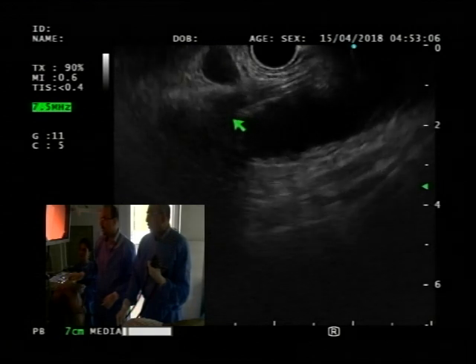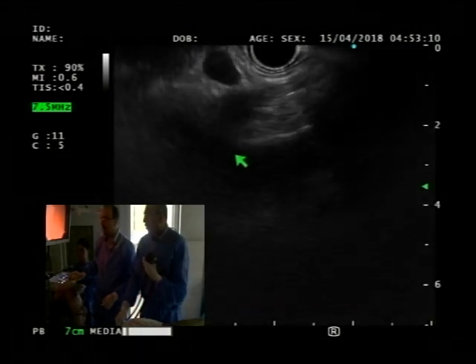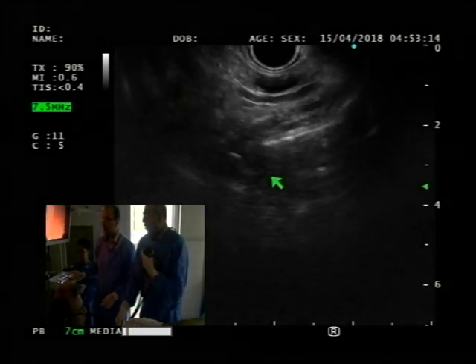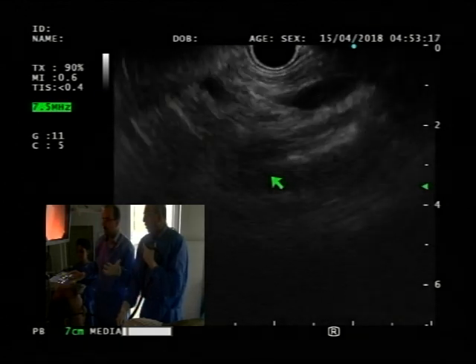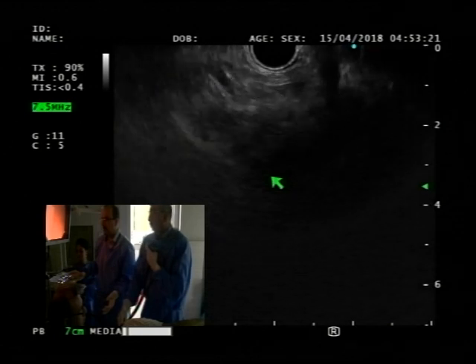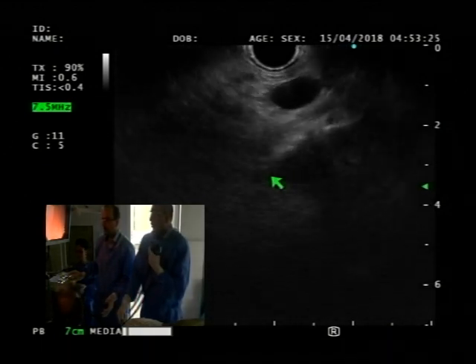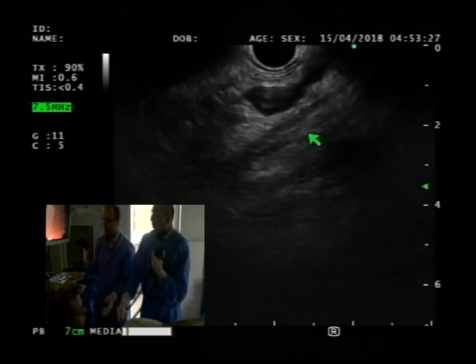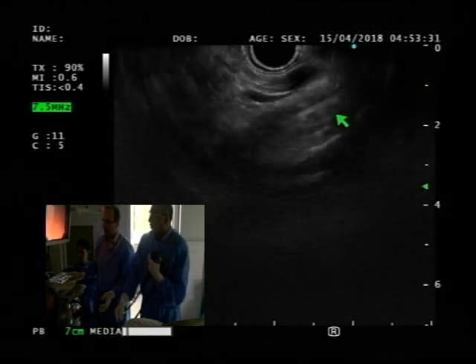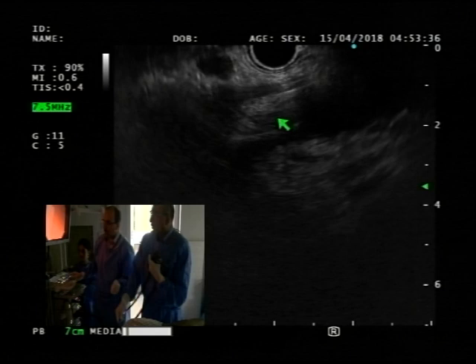So you may need to advance a bit more, but keep the aorta in view. Do whatever it takes to keep that aortic view. Maybe you need to thumb down a bit and then go counter. I think you may have advanced a bit too much, so go counter and then pull back a bit. There you go. A little more, and that's it.